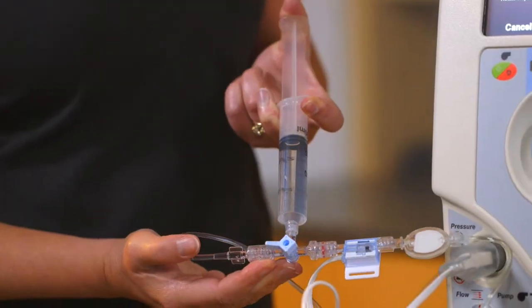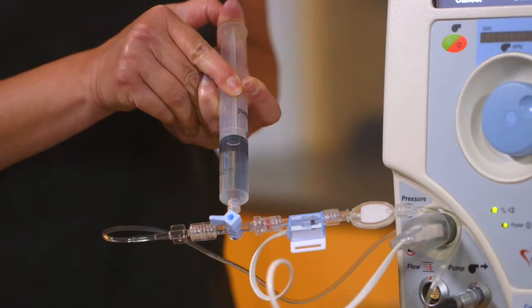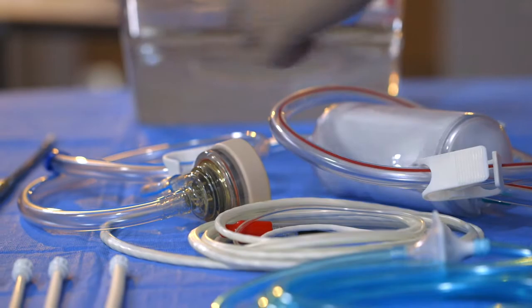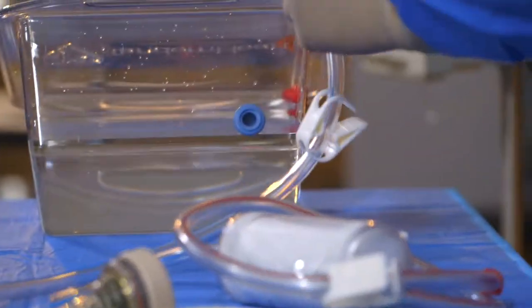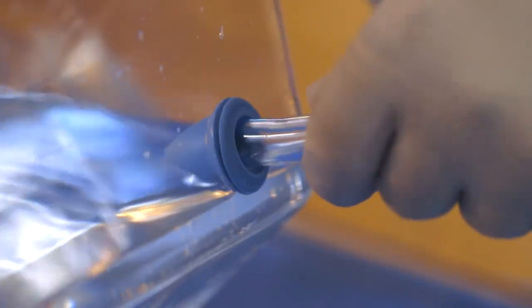Priming procedures must be followed carefully. Once it is confirmed that the lower housing is primed successfully and free of air, the sterile operator inserts the free end of the pump inflow tubing into the blue port of the priming basin.